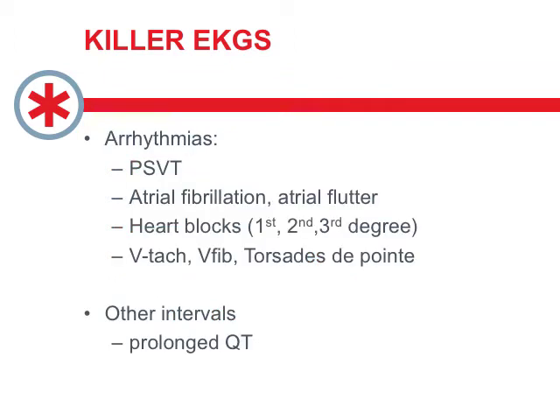And then finally, I think we need to have a good grasp on the arrhythmias, and one of the things that sets you up for arrhythmia is prolonged QT. So all of these that are listed here, we went through fairly briefly in the rhythm section. So we're not going to go through those again today, but certainly this would be a cadre of ECGs that we have to own, have to be able to recognize.